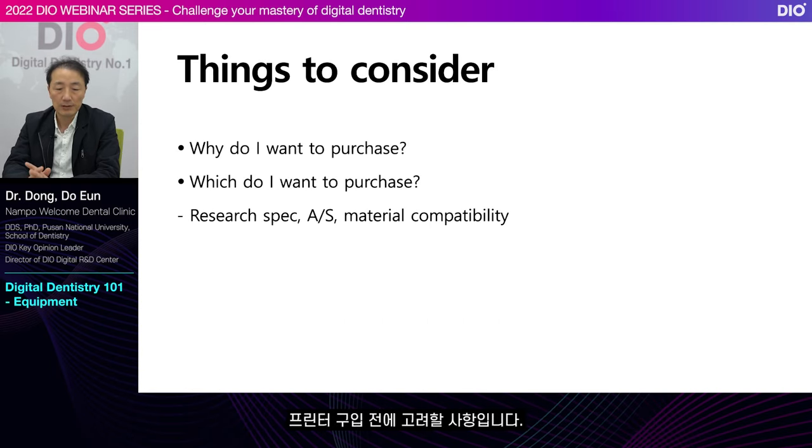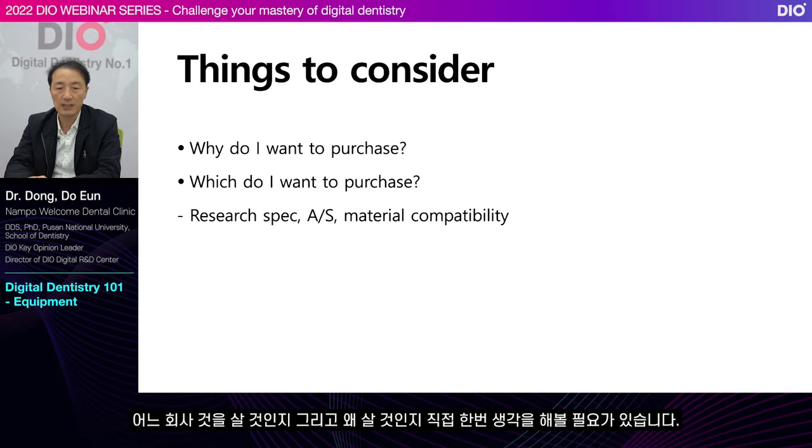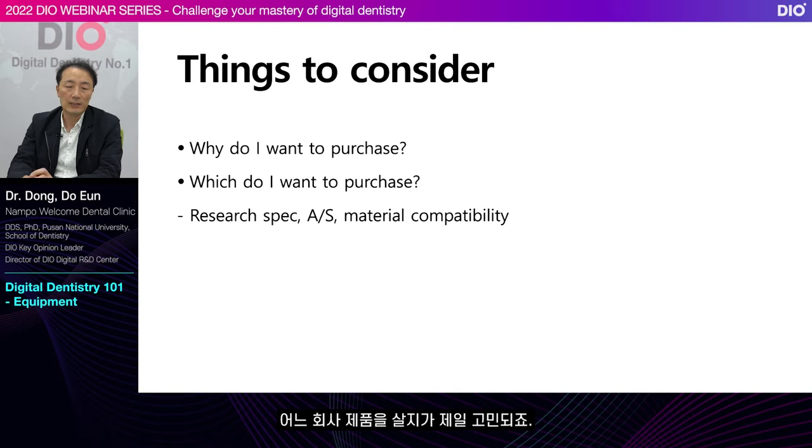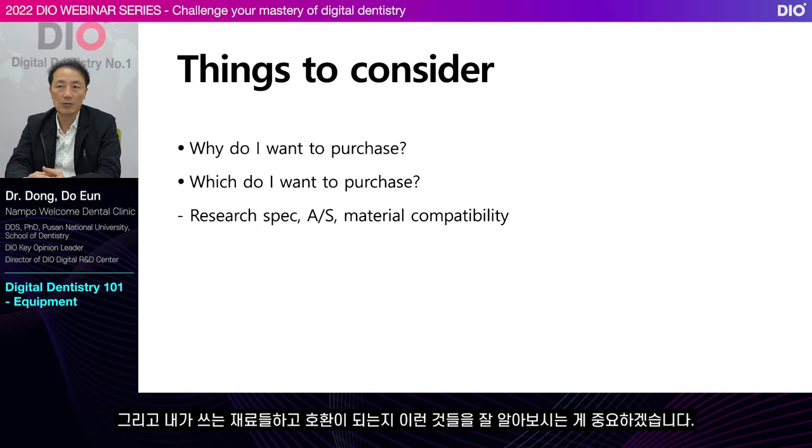These are things to consider before you purchase a printer. This is a small equipment that most clinics would consider buying. It's necessary to think for yourself which company you will purchase from and why you want to purchase it. The most difficult consideration is in choosing which product from which manufacturer to buy. Since there are various companies, it's important to check the specifications, after-sales services, and whether it's compatible with the ingredients I use.